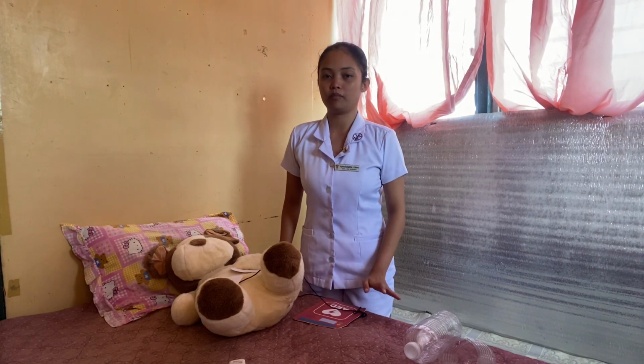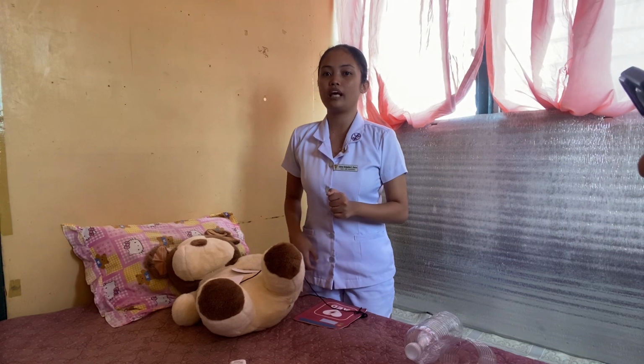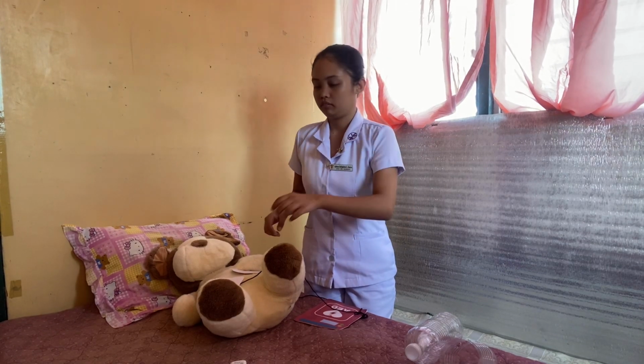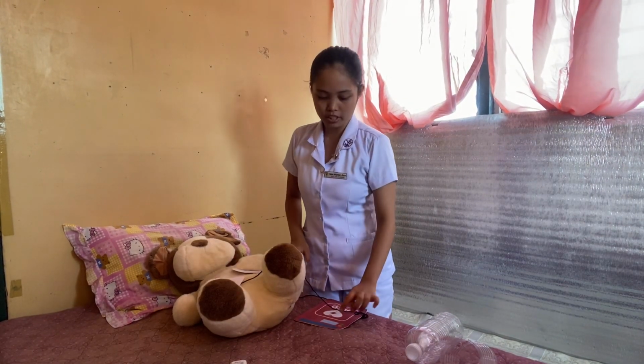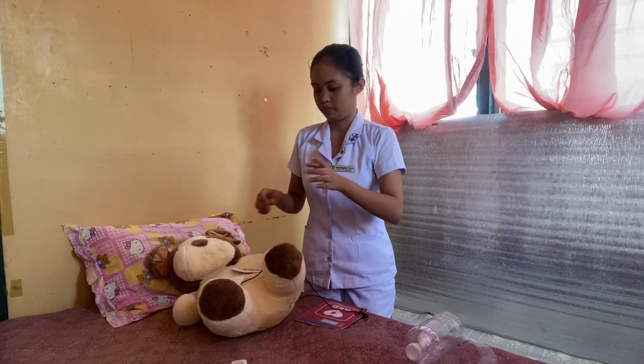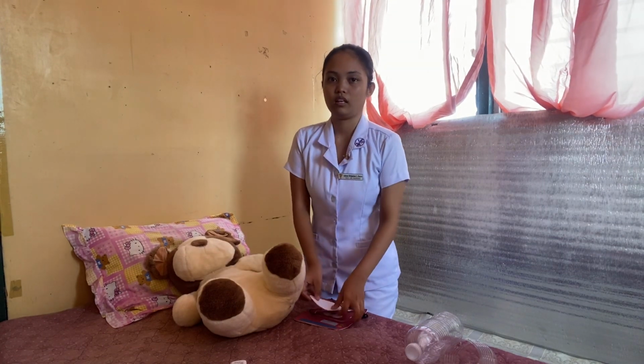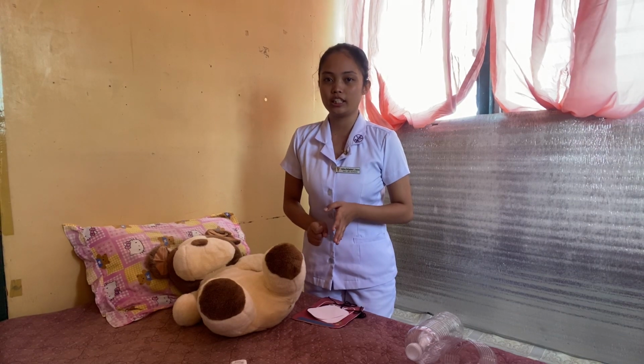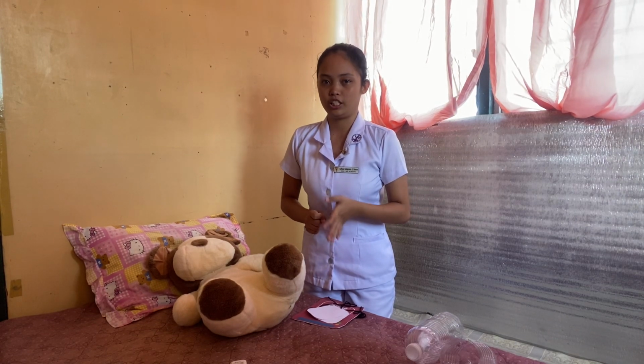Safely deliver a shock. Switch roles every 2 minutes or after every 5 cycles. Practice good team dynamics and reassess the patient after 2 minutes. If return of spontaneous circulation is not achieved, repeat the procedure. Once return of spontaneous circulation is achieved, place the patient in a recovery position and document the time of the procedure.